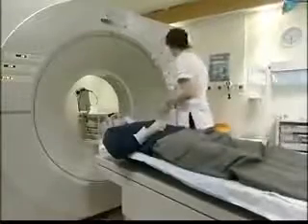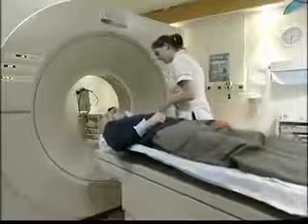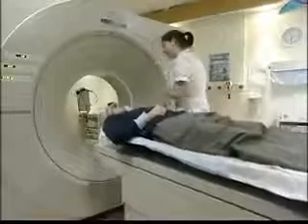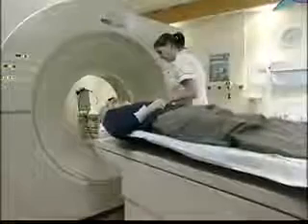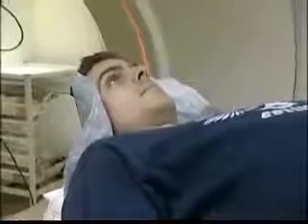Okay, I'm going to take some pictures of your head now, okay? So what I'm going to do is just raise the bed up and get you into the position. An initial X-ray of this patient revealed a fracture. However, the doctor responsible is also worried that there might be damage to the top of the spine, so a CT scan is being performed.